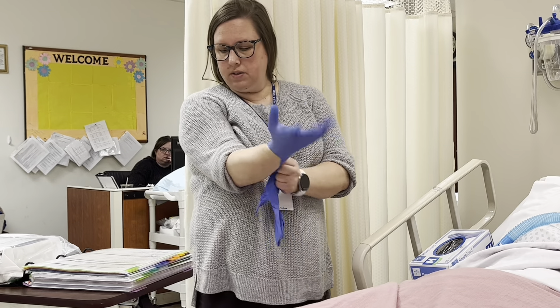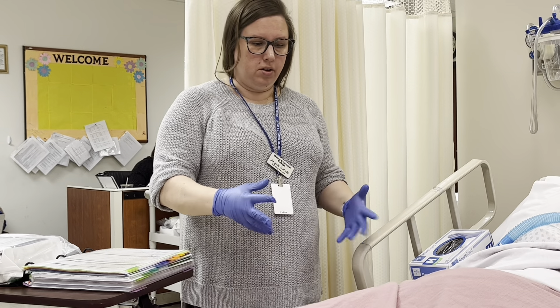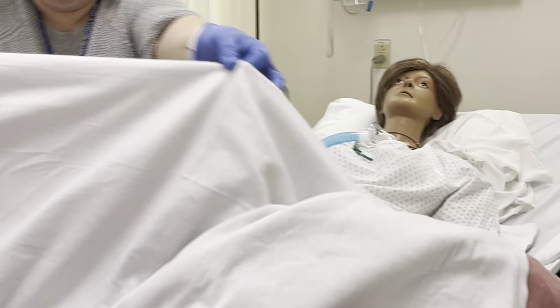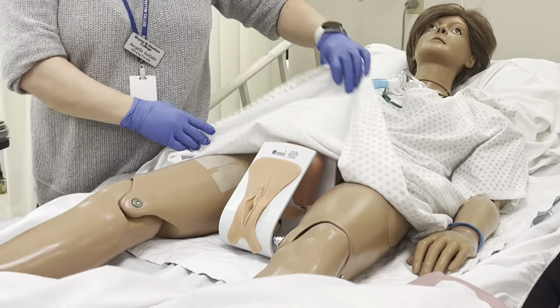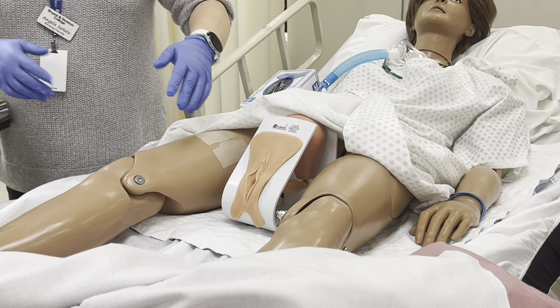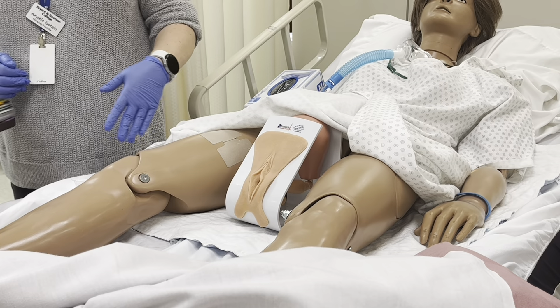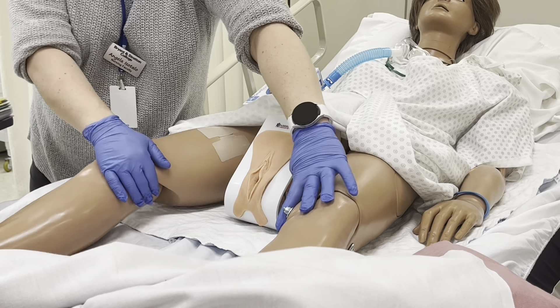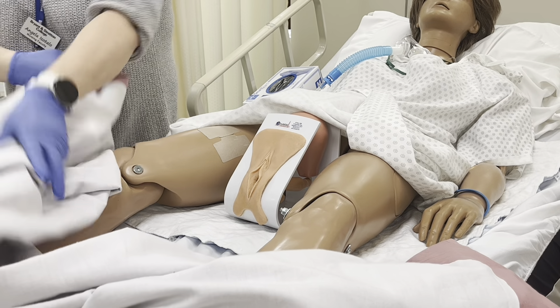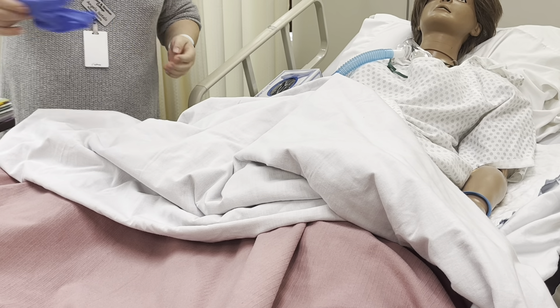I perform my hand hygiene. I'm putting on my gloves. I'm going to make sure that the bed is at an acceptable working height — I don't want to be hunched over. I'm going to pull back the blanket and look at her perineal area, assessing for any anatomical landmarks, any redness, any odor, any drainage. I would provide any perineal hygiene as needed. Because she's a female, I'd have her rotate her hips and knees out, making sure I have a wide enough area to work. I'm going to cover her back up while I get the kit ready and make sure there's enough light. I'm going to take off my gloves and perform hand hygiene.